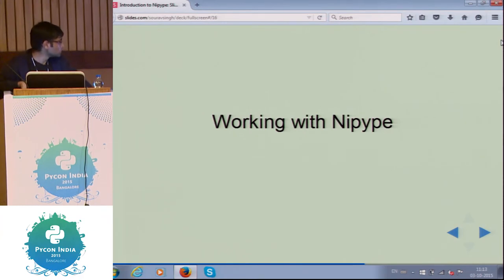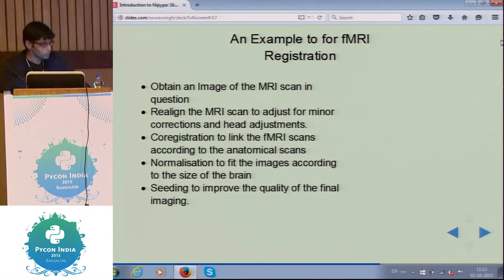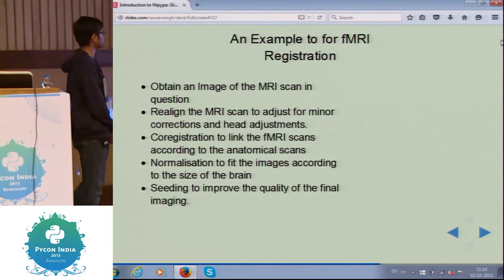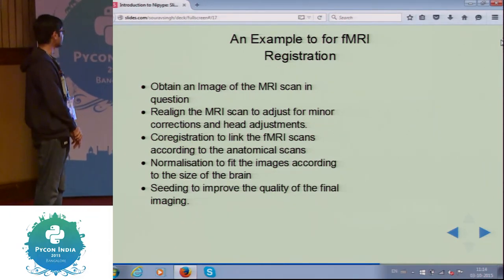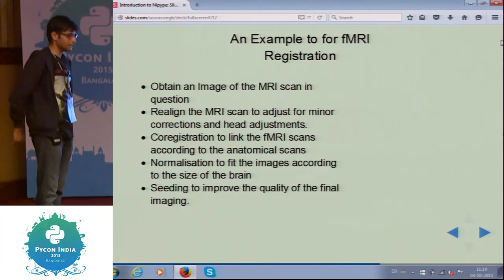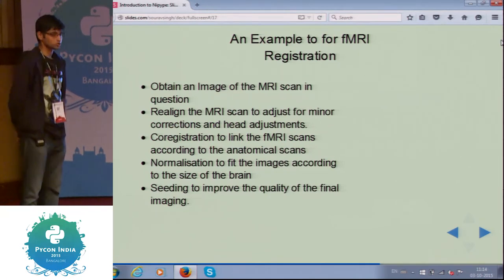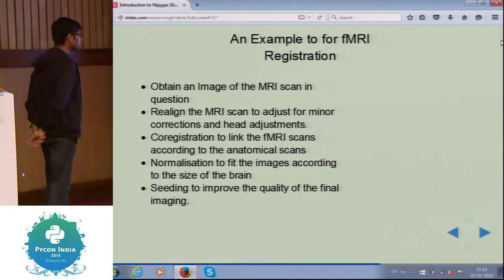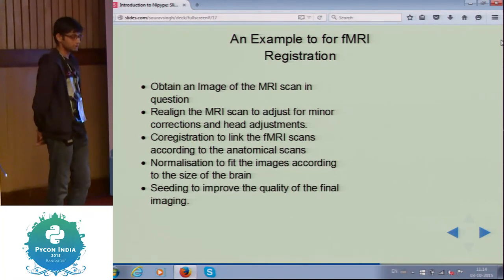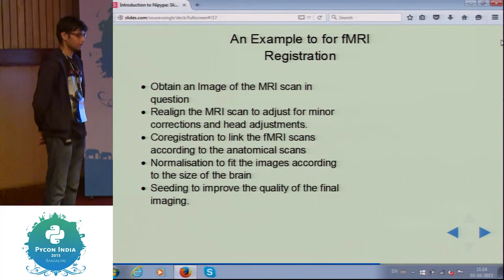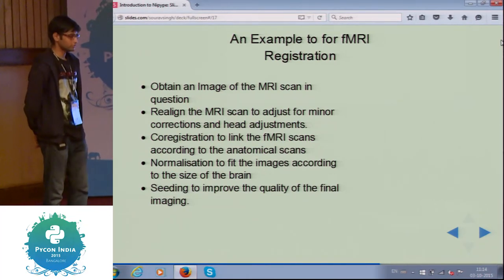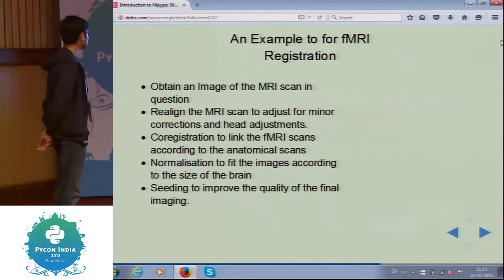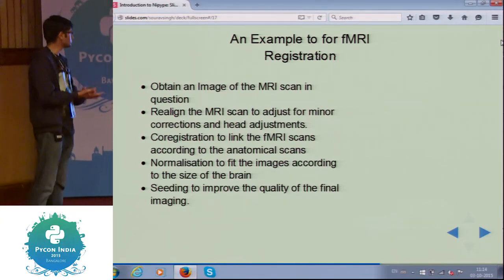Now we move on to some of the code for working with NiPype. Our example is: we are taking a functional MRI scan — it could be anyone, a monkey, a human, a Wistar rat, any species — and then we realign the MRI scan. Realigning means correcting for head bobbing and shaking in the equipment that occurs during an MRI scan, so we realign to make those corrections.